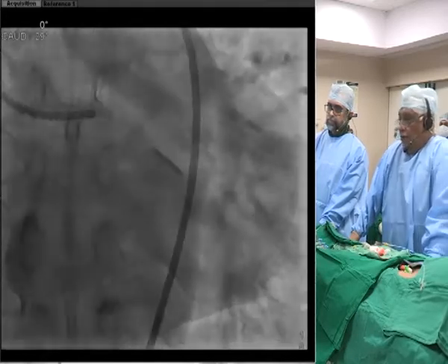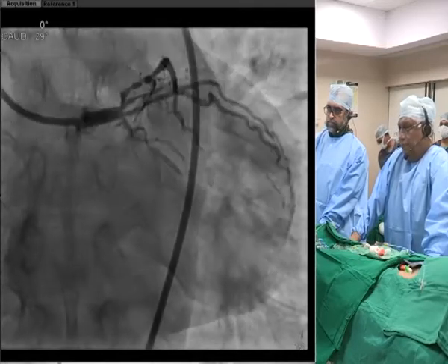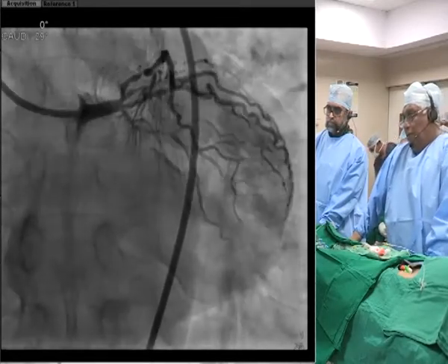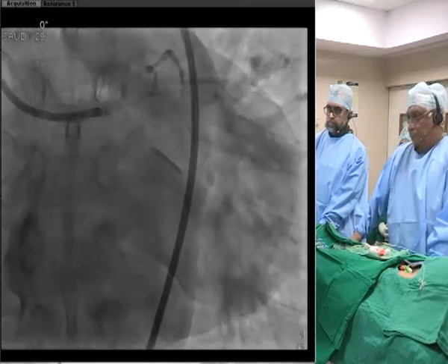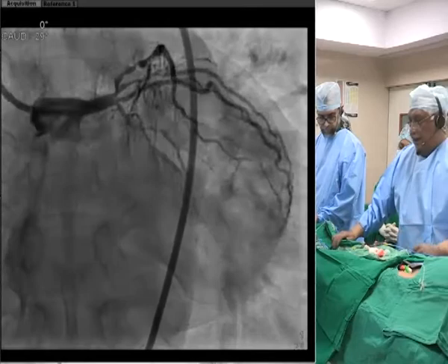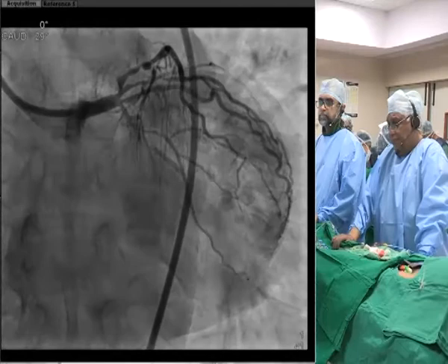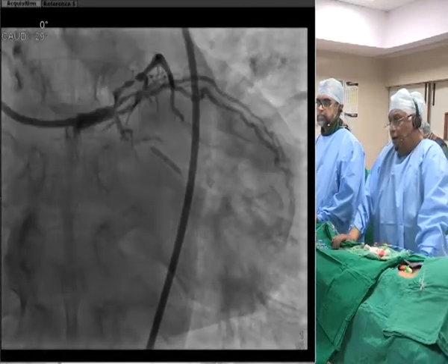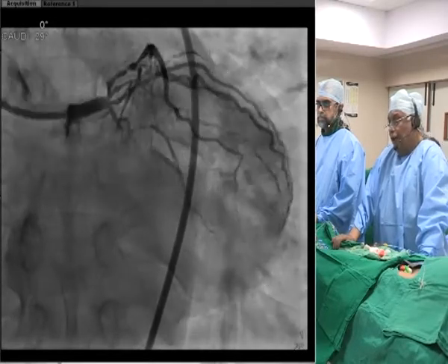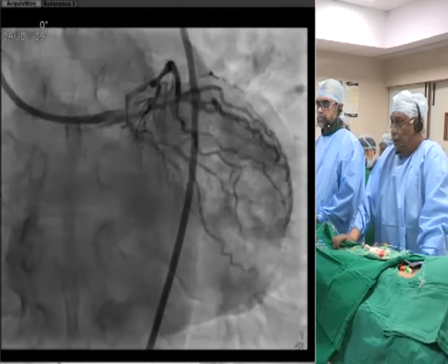Although not a left main, it's a left main equivalent, and that's how you're rationalizing it, and that's appropriate. Having the appropriate guide support and the ability to manipulate all three vessels simultaneously is important. Okay, so rather than complicating everything together, I have decided to tackle two vessels at a time. So the priority moves on to the LAD diagonal. Okay? So next.